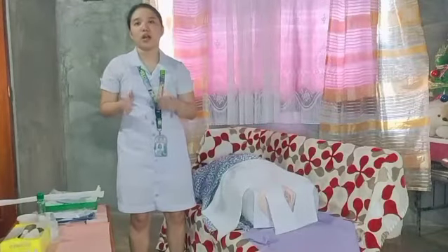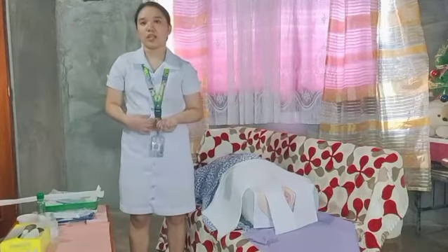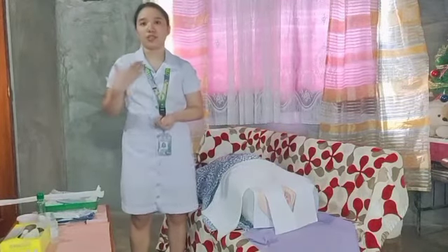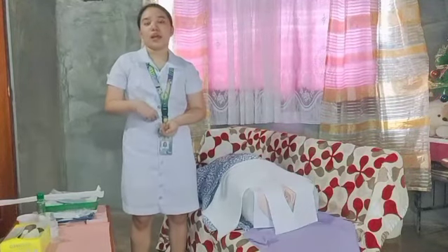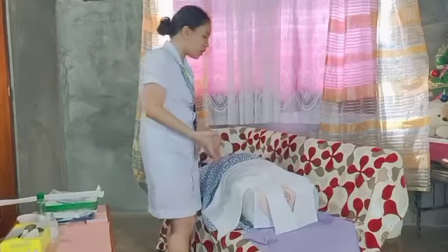Document the procedure according to agency policy, including patient tolerance of the procedure, any unexpected outcomes, and urine output, including the urine character and the color. So, ma'am, thank you po sa inyong cooperation.